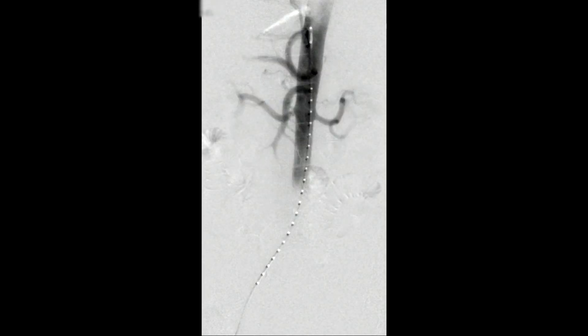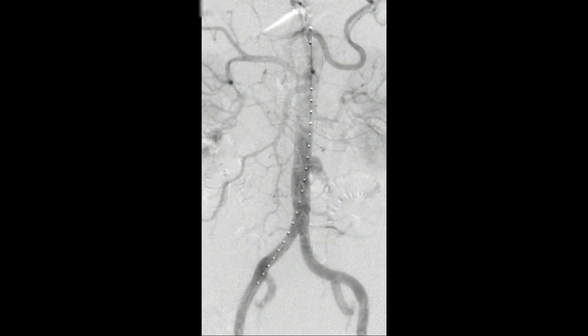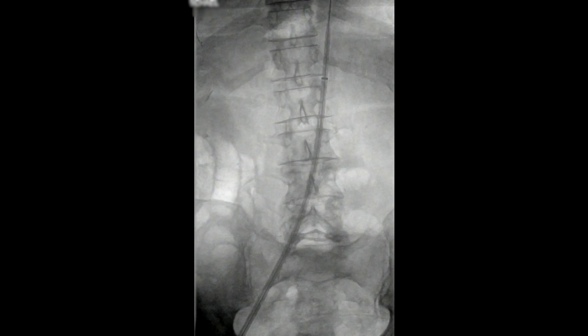We did do an angiogram, but we chose that angle really based upon the CT scan. This is more or less an AP view and you can see this outpouching in the left side of his aorta. A stiff wire was placed up into the descending thoracic aorta and there is a 14 French Gore sheath that is being placed through the right iliac system.